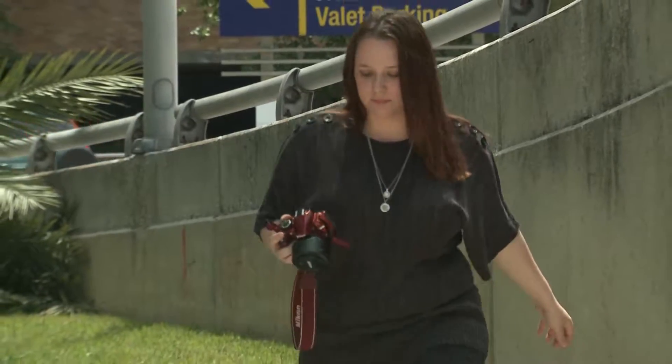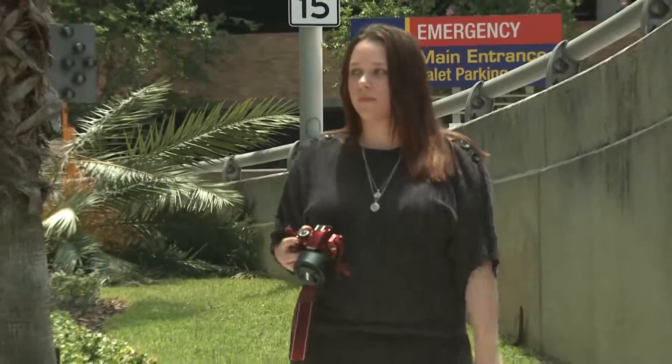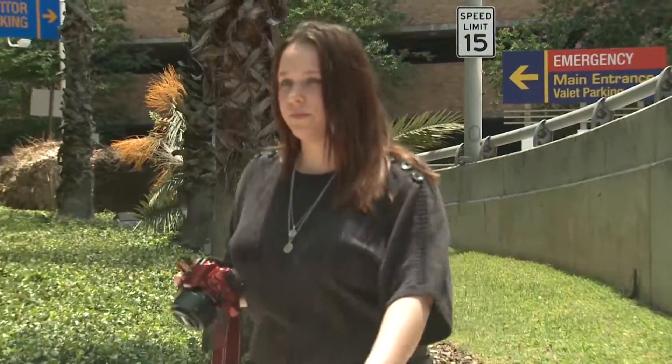Reoccurring breast lumps were to blame. Nothing she seemed to do helped at all, until a doctor recommended the Savvy Scout — a huge advance because it allows for more capability in more centers.